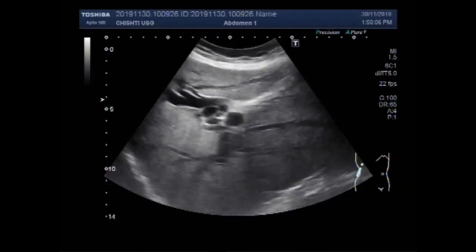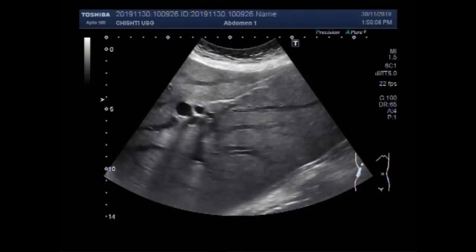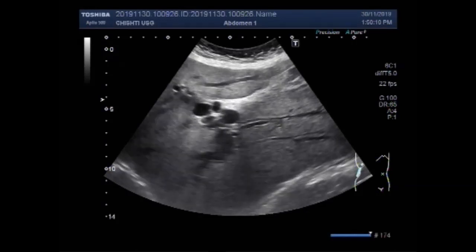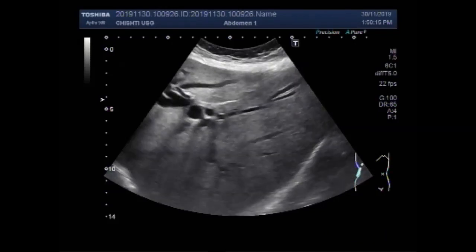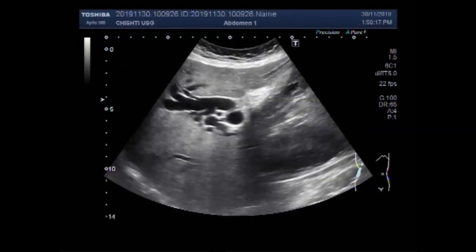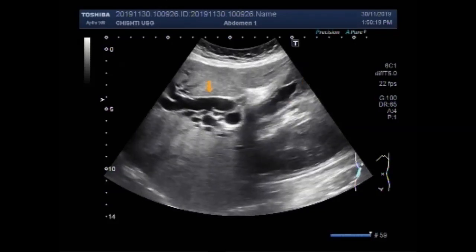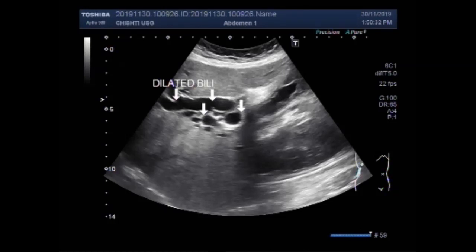You can see the liver, right kidney, gallbladder, and these are the dilated biliary channels. This is the dilated intrahepatic portion of the bile duct and dilated biliary channels.